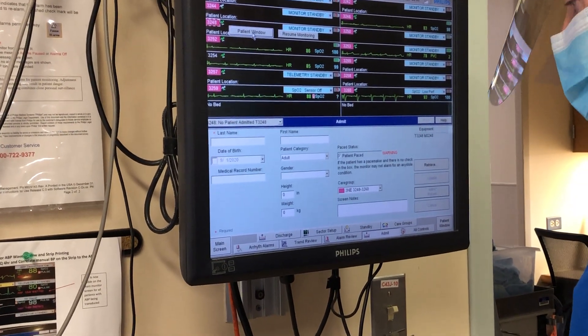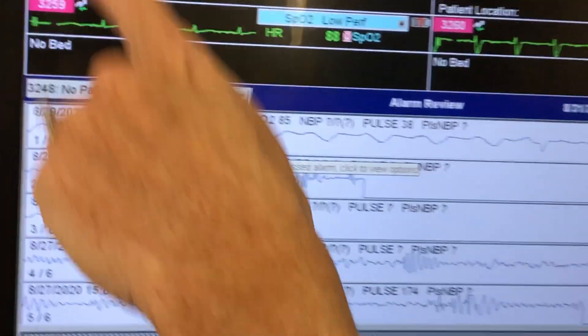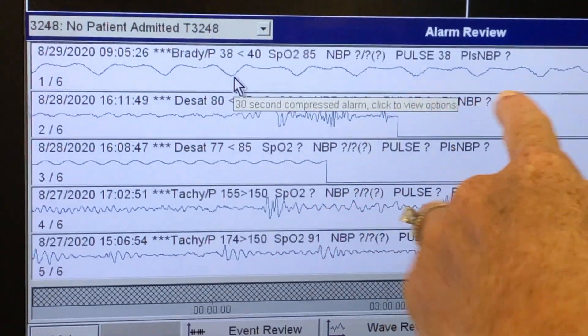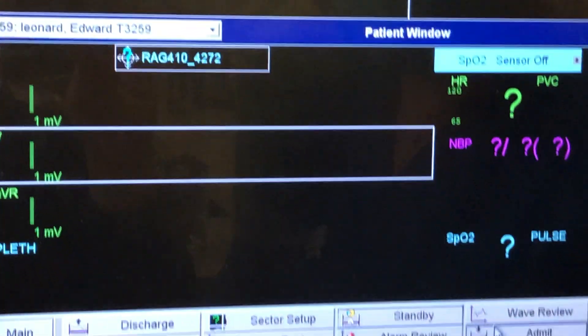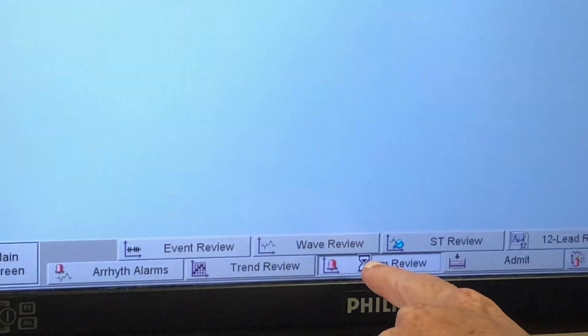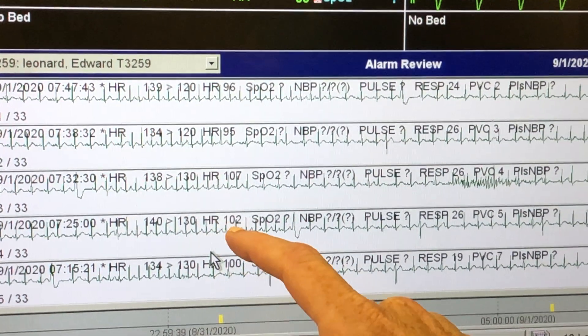The alarm review is important — you can go back and look at what happened. For this other patient, you can see in the alarm review it looks like his heart rate went high at some point — it just tells you what the alarm was.